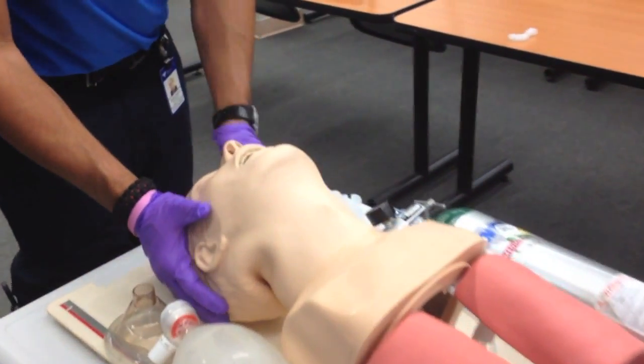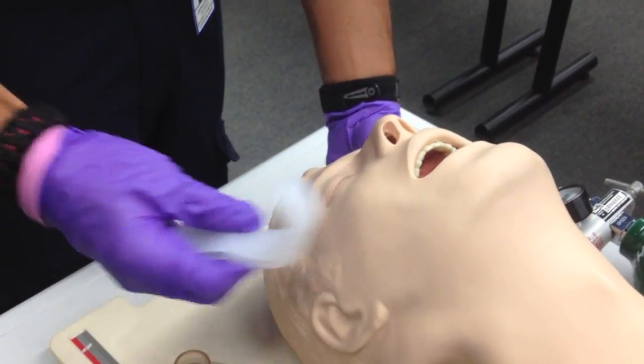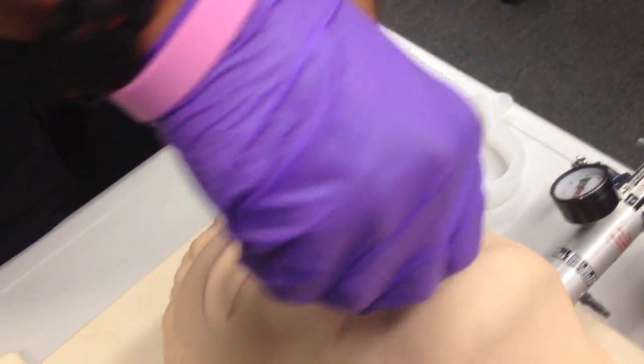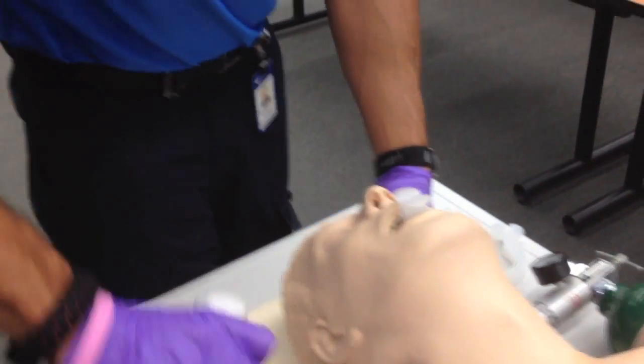Now I'm going to secure the airway with an OPA. I'm going to measure the OPA from the corner of the mouth to the tip of the earlobe. Once I have the proper size, I'll insert the OPA with the bevel facing the roof of the mouth, turning it 180 degrees until it sits flush with the lips. No gag reflex is present and the patient accepts the airway adjunct.